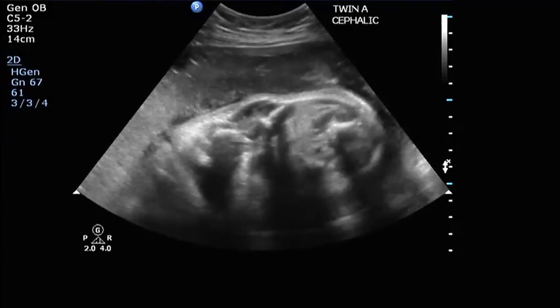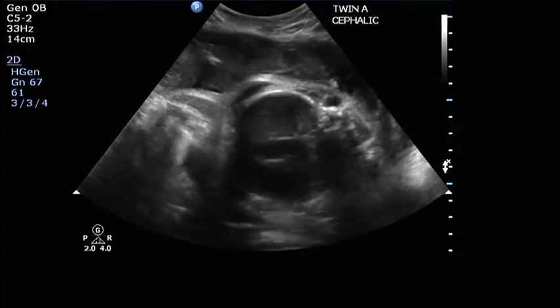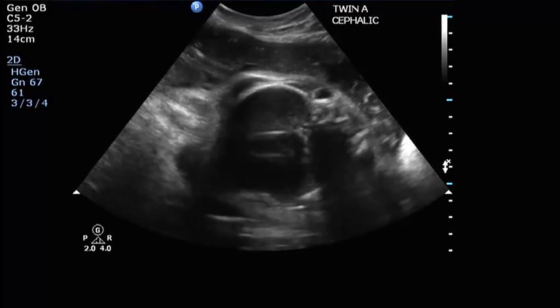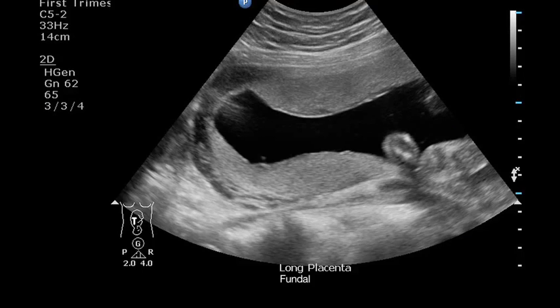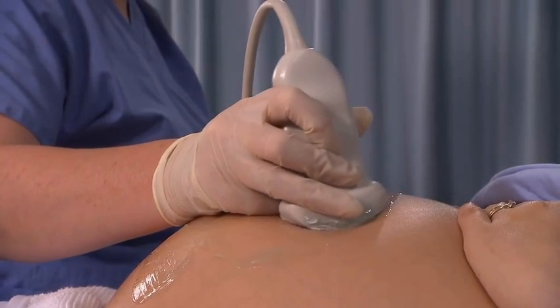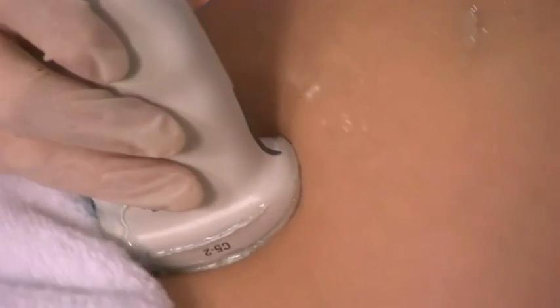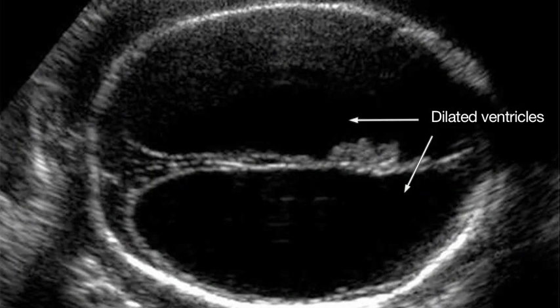Scan and assess the fetal lie, presentation and viability, fetal number, amniotic fluid and placenta position. Then perform a routine obstetric scan of each fetus, as well as a targeted scan if any pathology is noted.